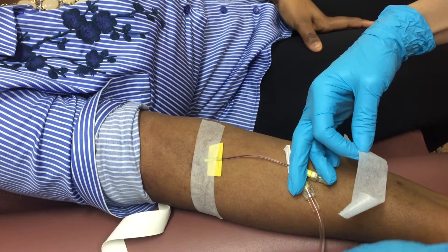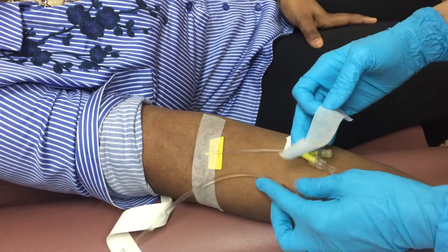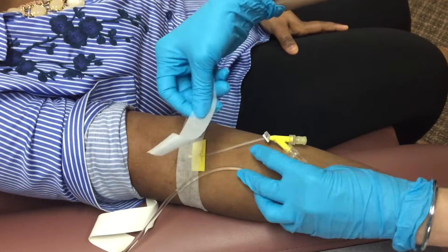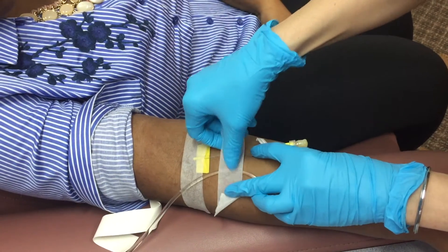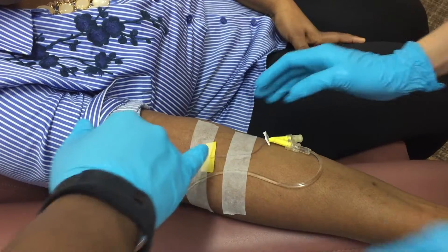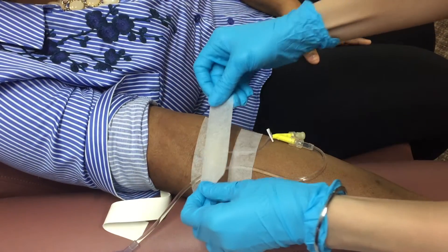Make sure to secure your line. It is a little more difficult placing your IV line at the cubital fossa because the patient can just bend their arm and your line is a little bit compromised. So make sure to communicate that part with the patient. For infusions that don't last very long, this is acceptable.